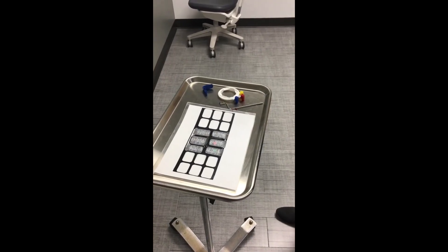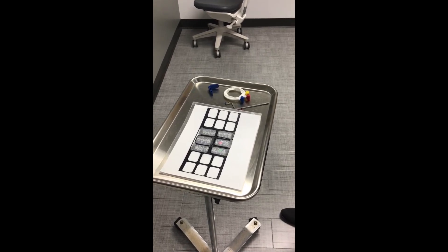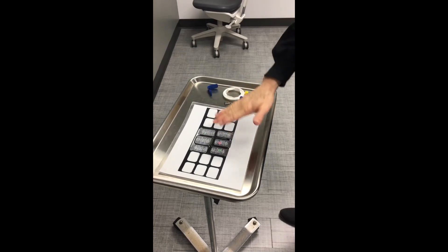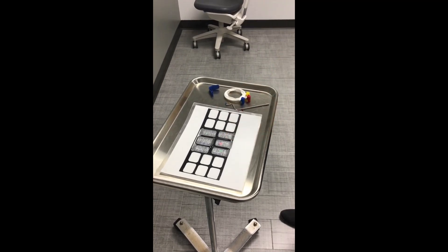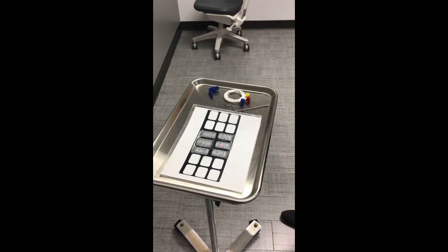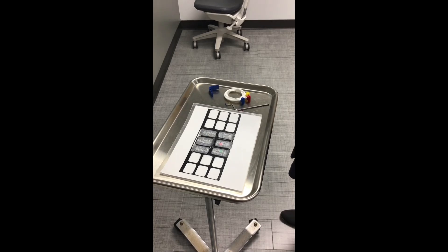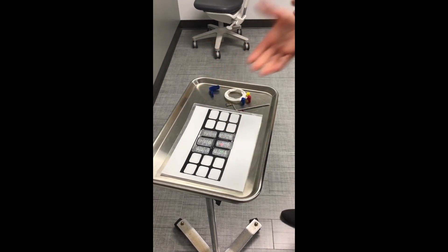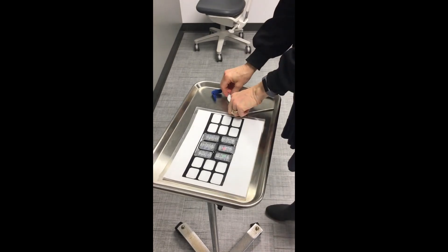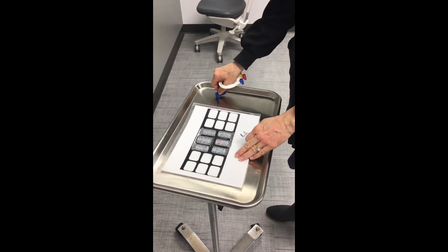We're going to demonstrate how to perform anterior projections using our XCP instruments and our PSP plates. Your protocol for taking anterior projections is the same no matter what modality you're using, whether you're using the PSP plates or the corded sensors. You're going to start by setting up your XCP instrument.